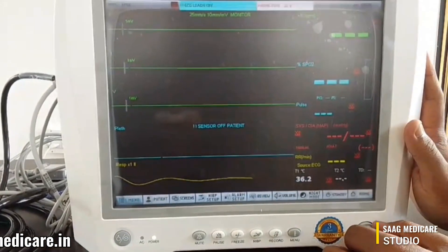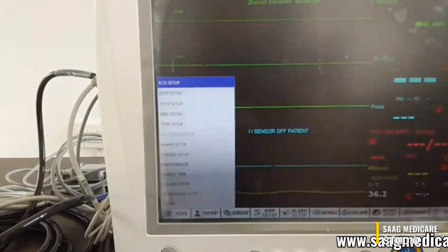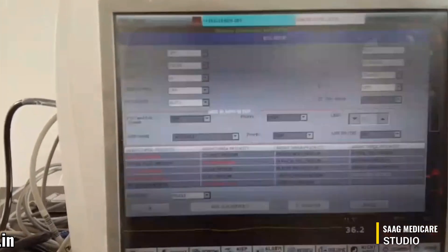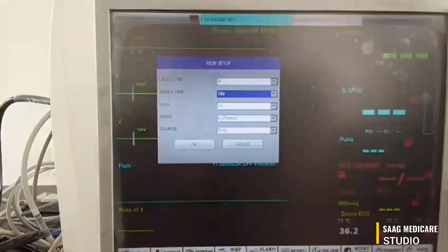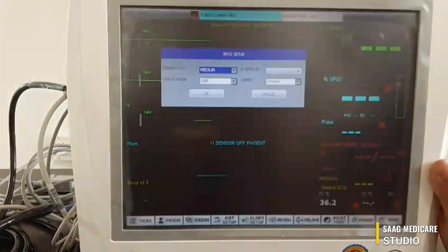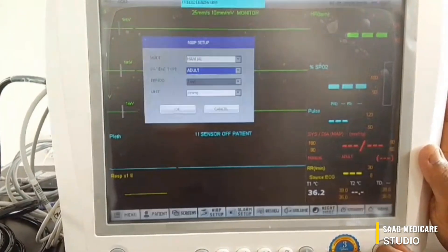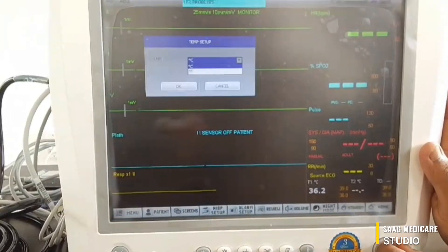You can select the menu option from the bottom or press the menu button. The first option is ECG setup — you can change the ECG settings based on your needs and click OK. The second option is respiration setup, where you can select the lead type and apnea type. There is also SPO2 setup, NIBP tab where you can select manual, auto, and patient type. The temperature setup allows you to change between Celsius and Fahrenheit.